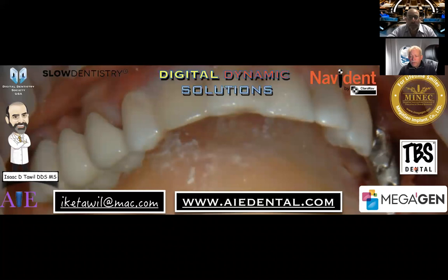And you very nicely showed that this is not just a procedure for anterior maxillary incisor cases. It's one that can be used to preserve, not just the buccal bundle bone, that area where we normally see resorption, but as you showed in the molar area, it's also about the volumetric changes that can occur when you have an extraction and you don't graft, or you have an extraction and then you place an implant without grafting.